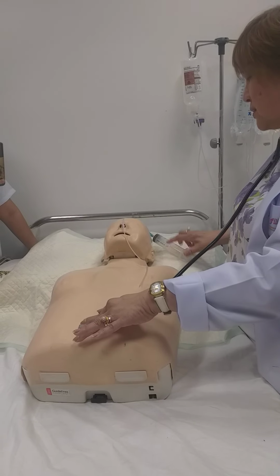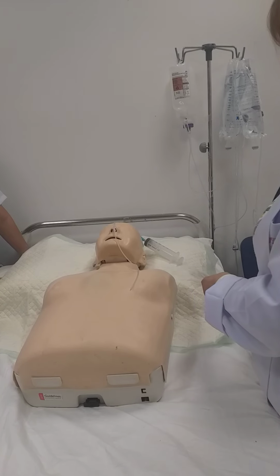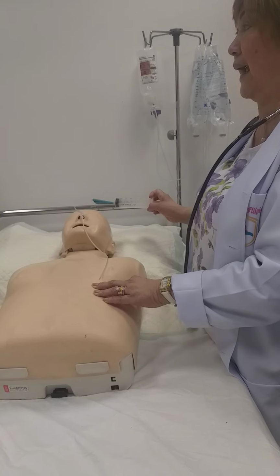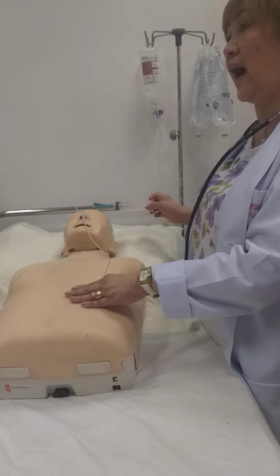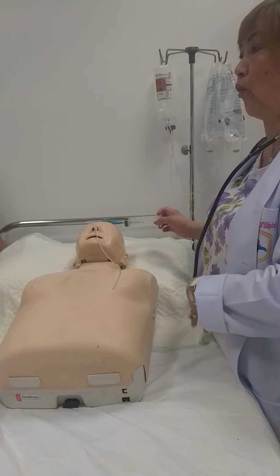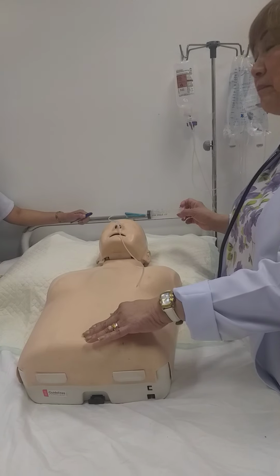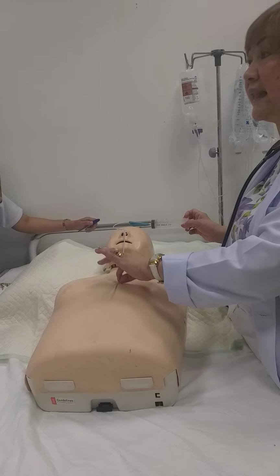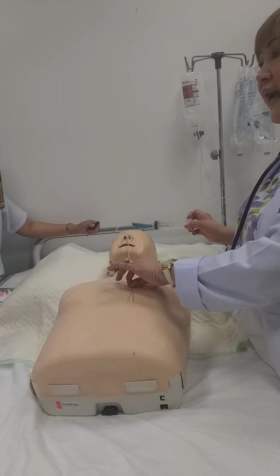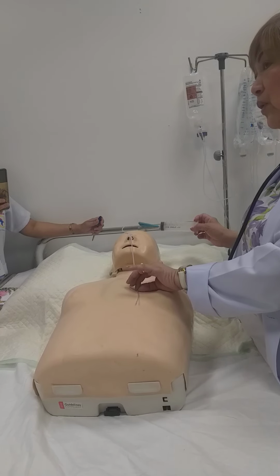Okay, now set aside, take this out, put it back. What you will hear when I push the air: there must be a bubbling sound, like you are hungry, okay? So if you heard that, it means to say your tube is in. If not, take it out. Redo. Do the same. Go back to number one.